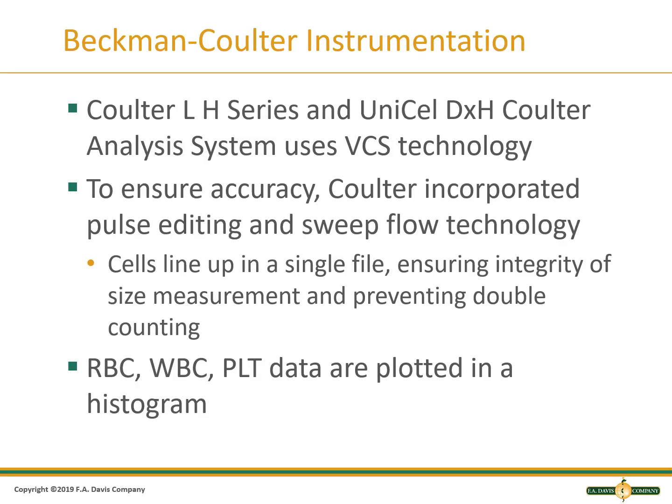Now these next slides, actually slides 23 through 55, are going to break down specific instrumentation that you may or may not see once you get to your clinical rotation and eventually your jobs. I did not want to cut this information. I encourage you to read through it. You can have this available to you. When you get to the point where you're starting your clinicals, you can go back and go, oh, okay, my site has a Beckman Coulter instrument in hematology. I want to brush up on how this instrument works. So I did not want to cut it altogether.